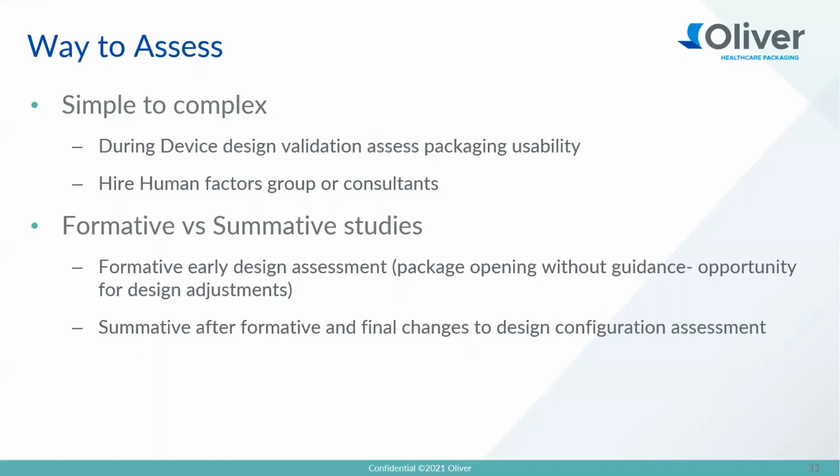For example, to make it simple, you can just take your packaging during your device design assessment and introduce the packaging to the end users and look at their abilities to aseptically open and figure out where the opening features are, etc. But you could also make it a little bit more complex and hire human factors groups or consultants to perform those assessments as well.